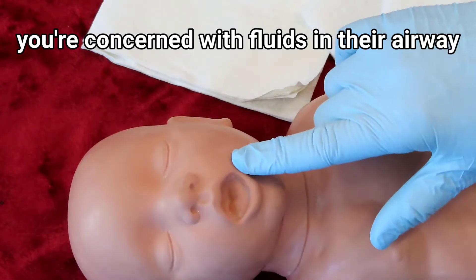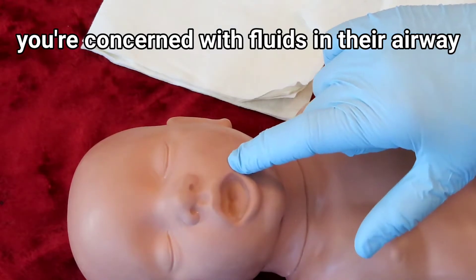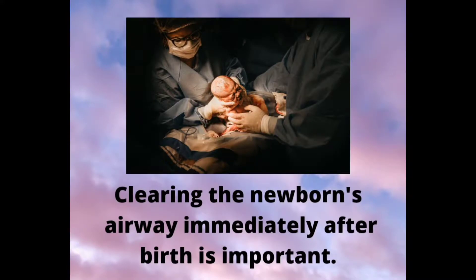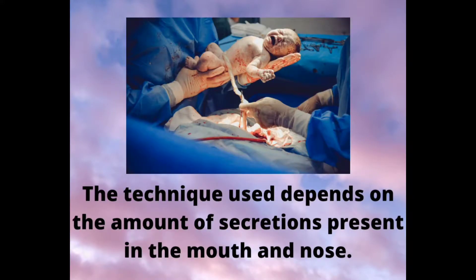When a neonate is born, you're concerned with fluids in their airway, both the mouth and the nose. Clearing the newborn's airway immediately after birth is important. The technique used depends on the amount of secretions present in the mouth and nose.